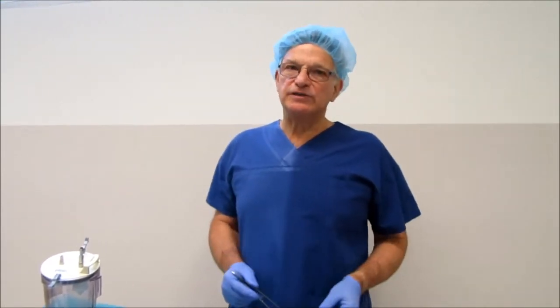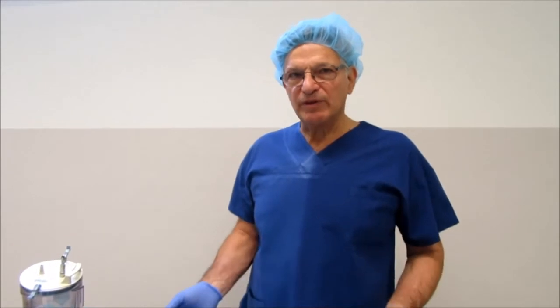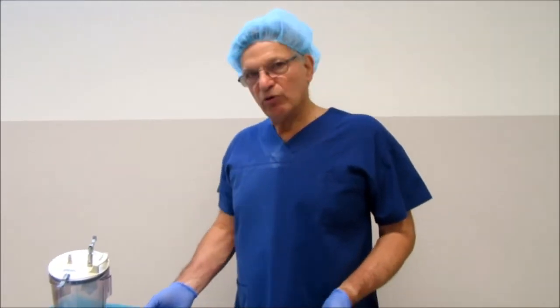We did a total capsulectomy, a breast lift, and also fat transfer to replace the volume. I'd just like to show you what the implants look like on removal today.